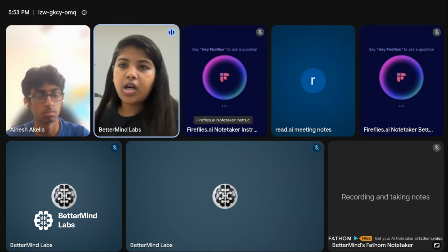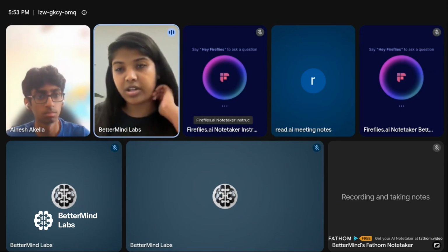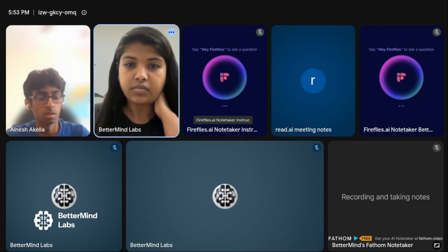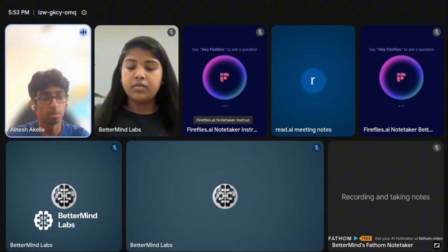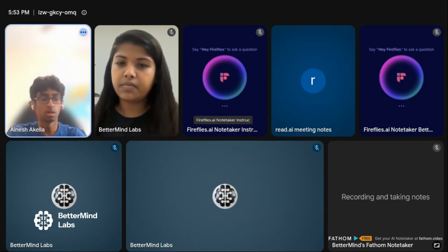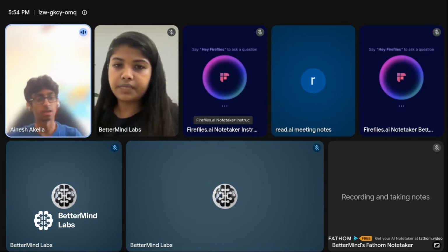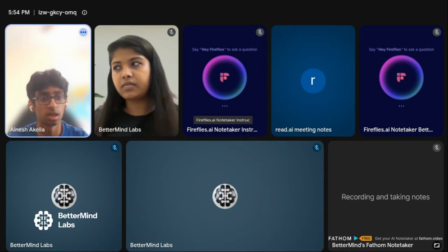Okay. Next, how confident do you think the product is? What's the accuracy currently, and how are you trying to improve it? I think in the future, I'm going to try to implement a pre-trained AI model in order to make it more accurate using the different diffusion weights. But I think for now, the accuracy is fine, but it's not as good as I would like it to be.